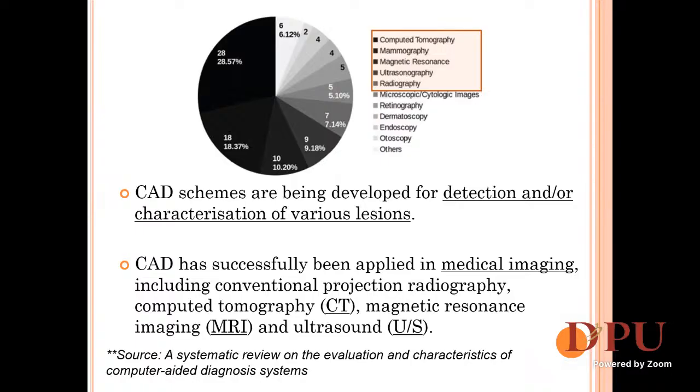And once we deal with such images, why do we need to store this whole data set, whatever data set we have, into a CAD system? Basically, we are talking about 70+% radiological images. The remaining few cases, as I said, ophthalmo, maybe derma, maybe sometimes endoscopy, are not radiological images, but still CAD can be deployed. But mainly CAD systems can be deployed on radiological images. That is the main thing.